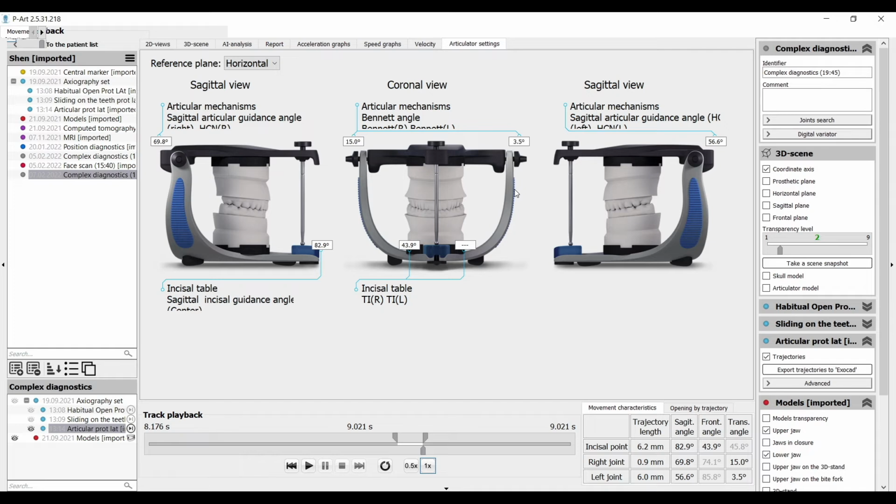Take the left angle of the sagittal articular path, which is typical for right laterotrusion movement. The right canine trajectory guides the left joint in laterotrusion movement. That's why you take the calculation of the left sagittal angle of articular path and recalculate it into canine guidance. Classically, the right canine guidance parameter is bigger than the left articular guidance parameter by about 0 to 5 degrees.